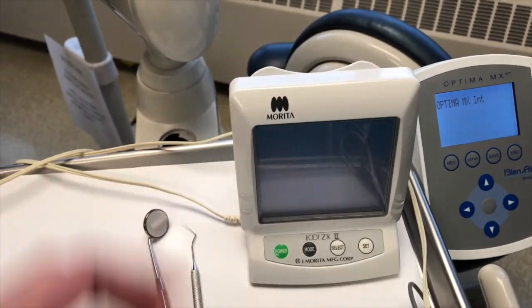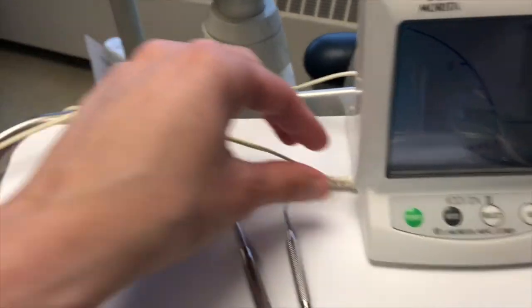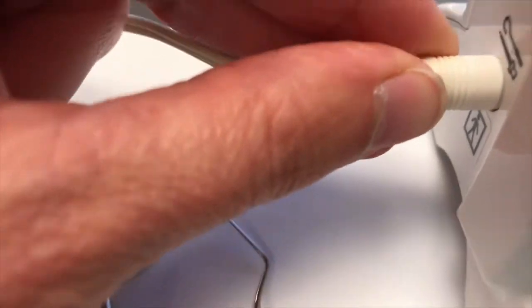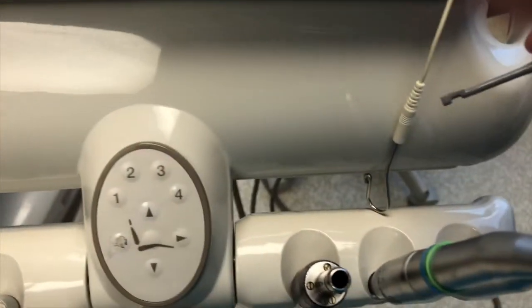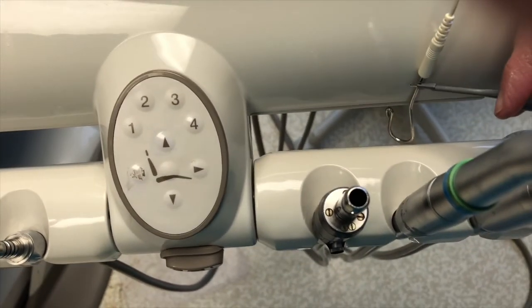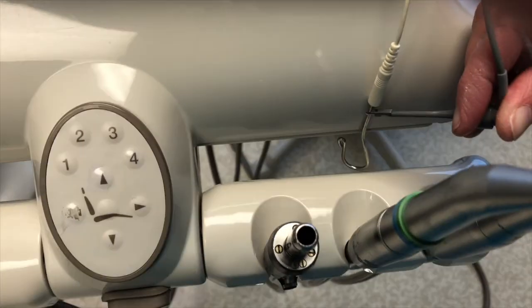I'm going to turn it on before I plug the probe in, because it needs a moment to calibrate before I plug it in. I'm going to come to the side here and plug it in. Then what you want to do is just do a function test to make sure you have connection. I'm just confirming that when I hit the clip and the part that goes on your file, we have connection.